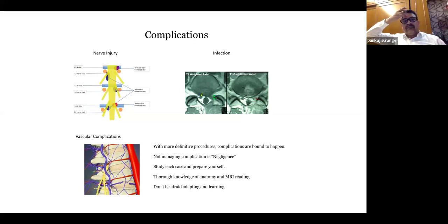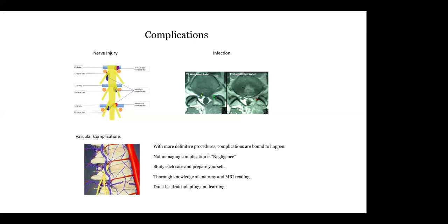In fusion, we have to go inside the disc and remove the disc material completely. The other thing is foraminal and extraforaminal disc of L5S1, in which we need transforaminal surgeries only, either transiliac or suprailiac.